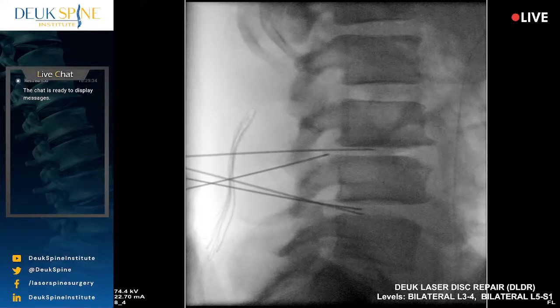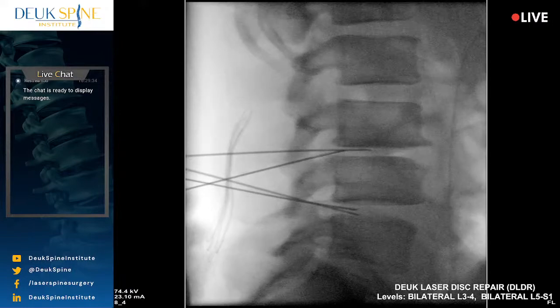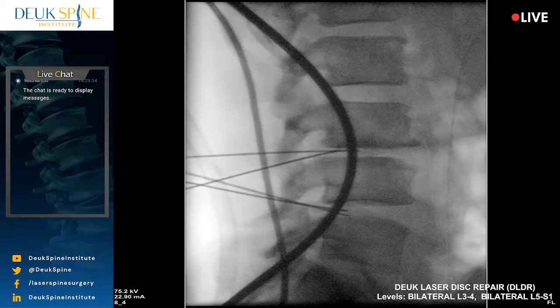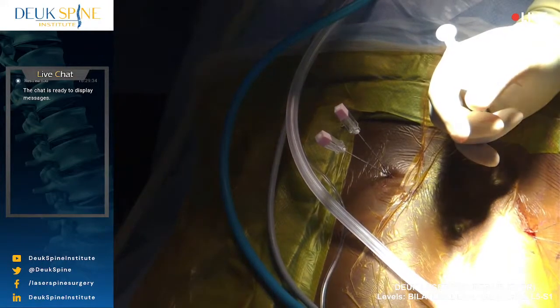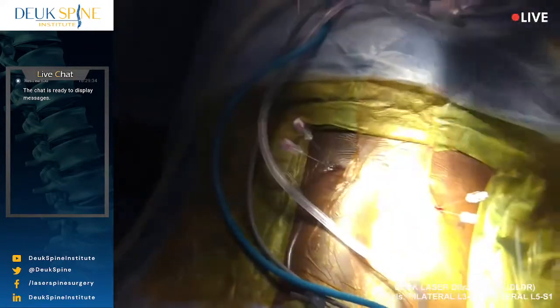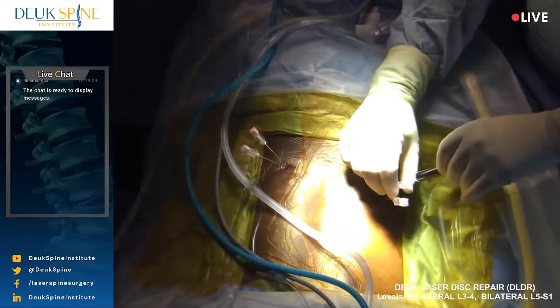Shot. Oh, that's a really calcified disc, by the way. I mean, not calcified, collagenized. Are you comfy? Sir? Yes. We're done. We're going to put you to sleep in about five minutes now. I just want to test these discs, okay? You remember this part? You've watched my surgeries, right?